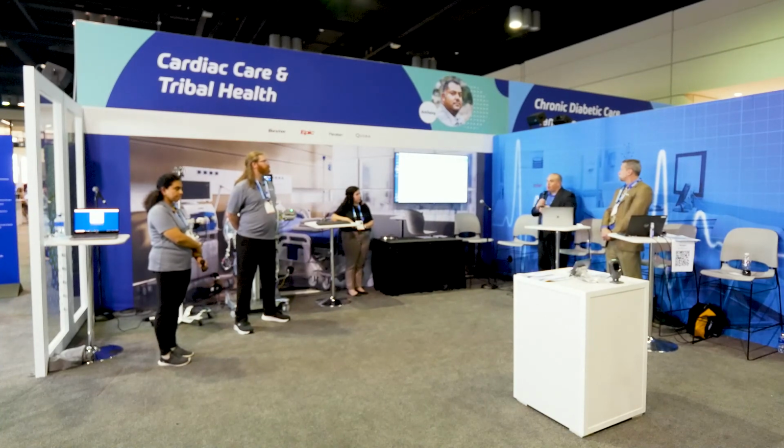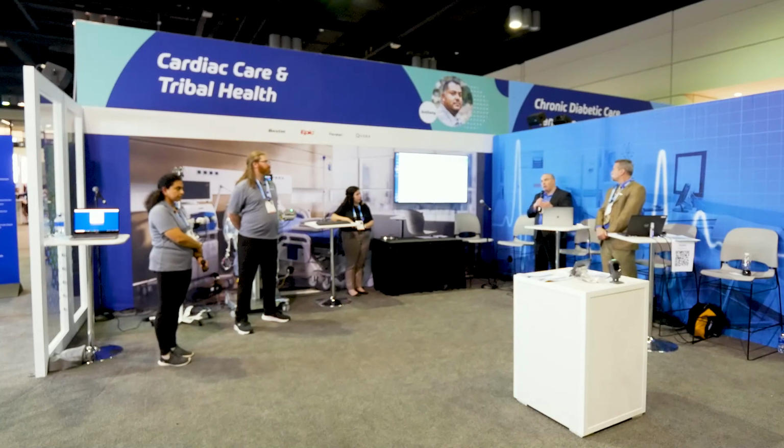And then with the pumps, we're using HL7 for the CRRT machine to get those vitals every minute to help the documentation and reduce the amount of documentation clinicians and nurses have to do. And then for the pump, they were using HL7 to not only send the order to the pump to improve accuracy, but also send back data for auto documentation to, again, reduce the time that clinicians and nurses are taking to do that.